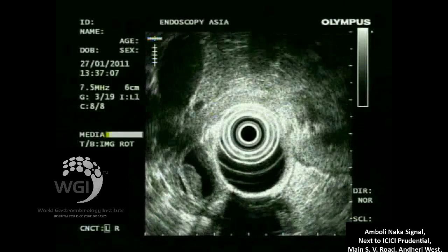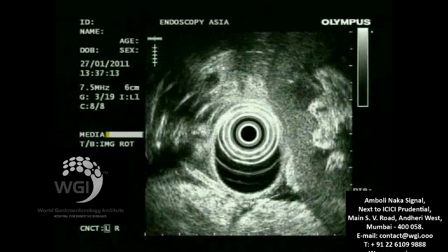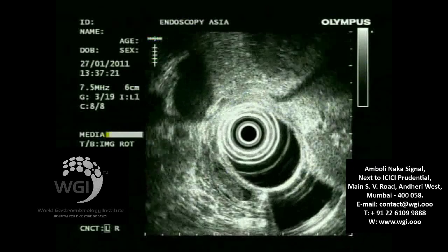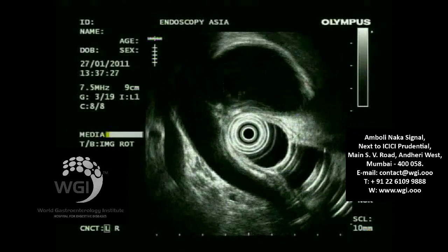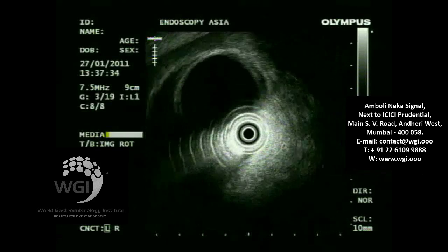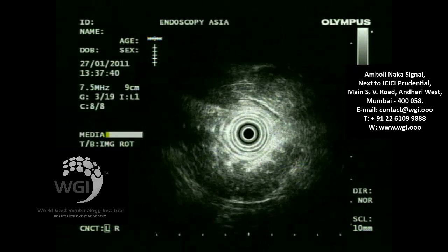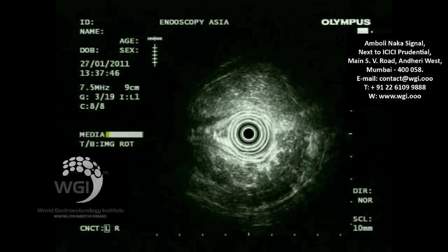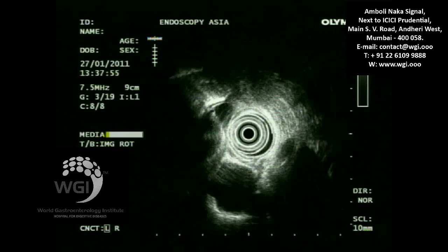Then the purulent bile can reflux into the pancreatic duct and can cause pancreatitis. You can see that impacted stone there now. Yes, this is the impacted stone, very well demonstrated at 6-7 o'clock position. One has to really master this over a period of time. You'll be able to see these difficult areas with some practice. Very gently we are coming out. We saw the pancreas. There is some edematous pancreas in the body, no doubt about it. Some lobulation as well, and no obvious mass lesions.